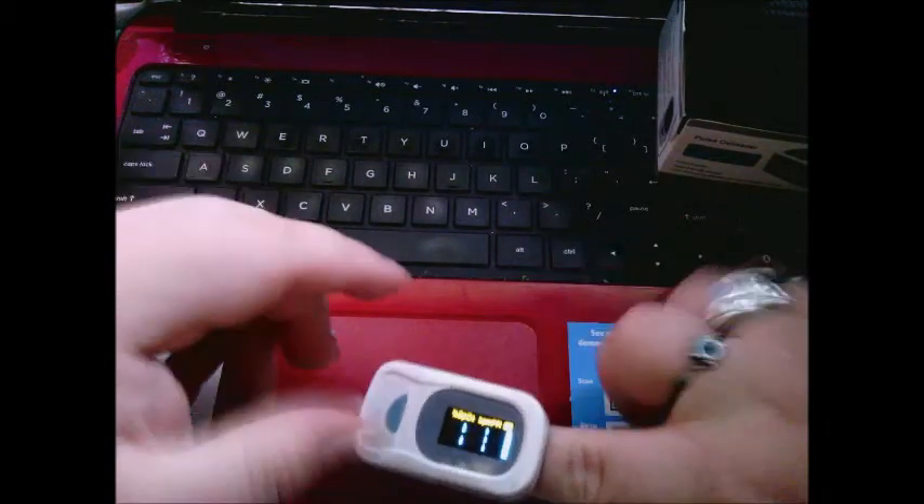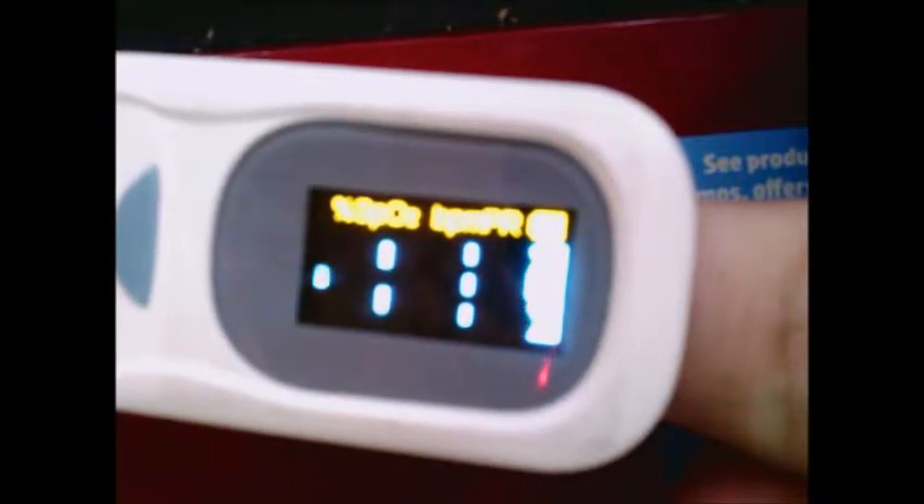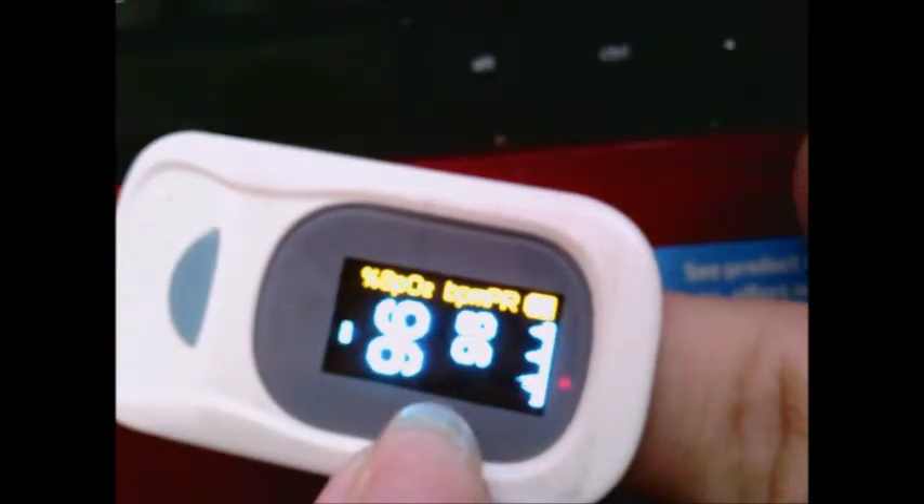To get started, you just push the button, stick your finger in, and wait for it to start reading. As you can see, mine is reading 93 to 95% oxygen saturation — it just jumped up to 94% — and my heart rate is about 90 beats per minute.